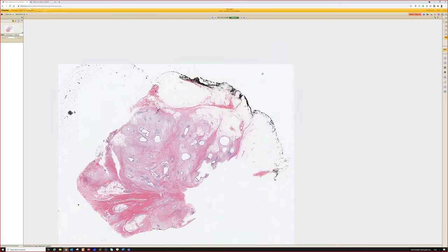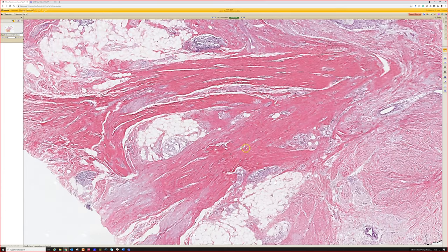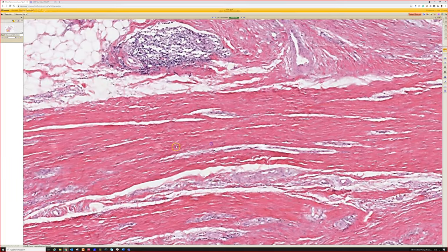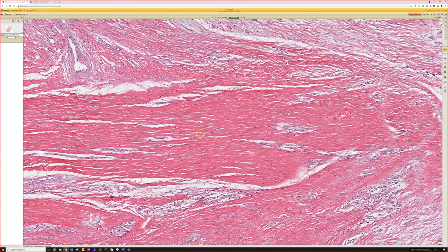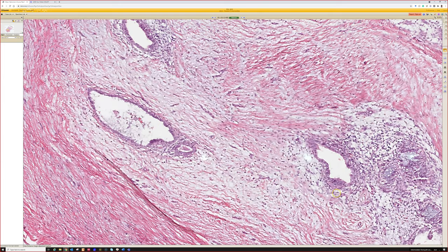Okay, 12. Where are we at here? No skin. This looks to me like dense and wavy, a little bit like ramen noodle. So I wonder, is this like fascia, tendon sheath, something like that? I mean, it could also be scar, but it seems so regular that I think we must be down deep near the fascia at this point. And then we've got spaces.